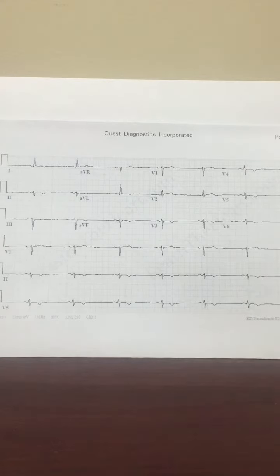Okay, so now we're going to talk about adult bradycardia with a pulse. So once again, this patient is going to present much more stable than the past patient we talked about with pulseless VT or VFib. So first you want to make sure that the patient is bradycardic. So for example, we'll get an EKG, and in this case, this is an example of a patient with bradycardia.